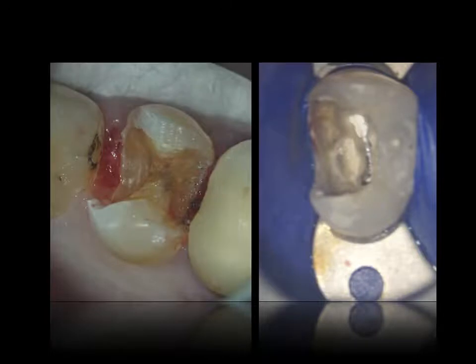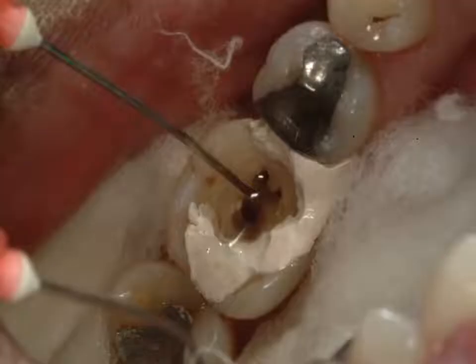What happens most commonly with sodium hypochlorite is burning of the tongue, burning of the mucosa or soft tissue, which happens because of negligence and not because of sodium hypochlorite itself. We may have cavities under rubber dam which may show leakage, and sometimes you don't even use a rubber dam, which means the hypochlorite leaches into proximal areas, causing tissue burn and flowing into the sulcus and vestibule.